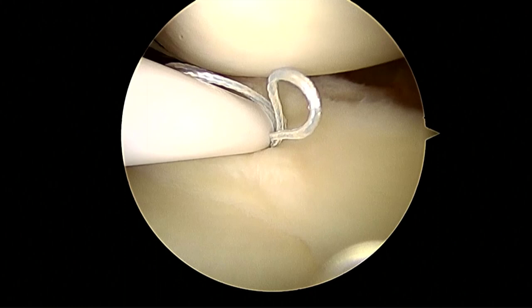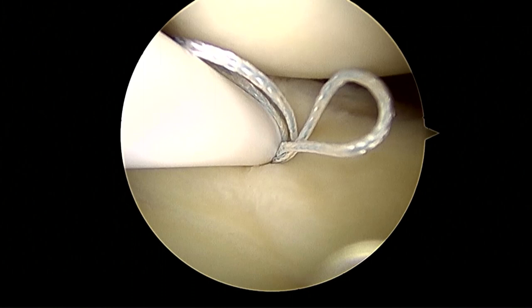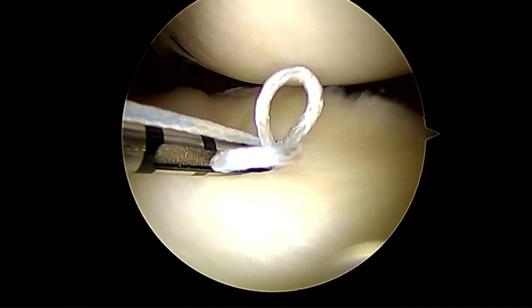This is after the trepanation preparation of the peripheral part. This is the cannula. This is the depth. This cannula will avoid too much penetration there. The needle is going from the substance of the meniscus towards the periphery.